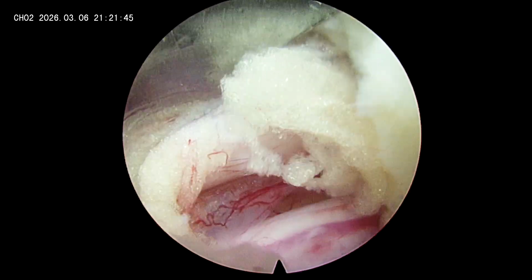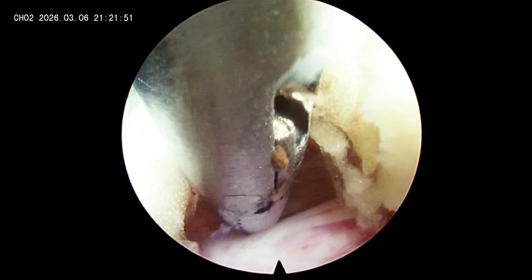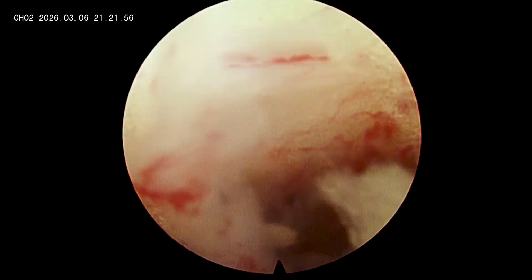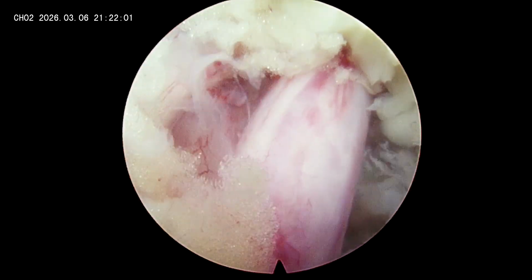So we are done. You can see a free and mobile traversing nerve root. I just want to show you the amount of flavotomy incision here. So the root is free.